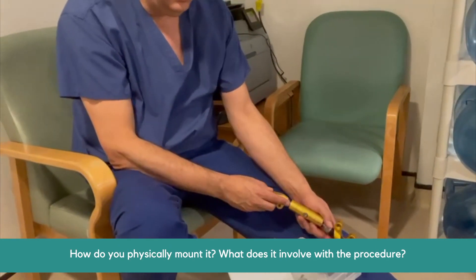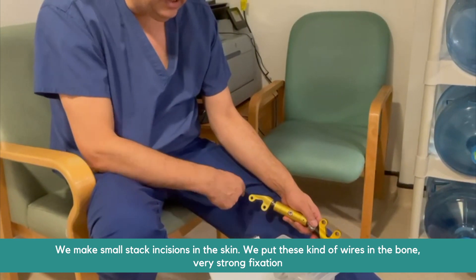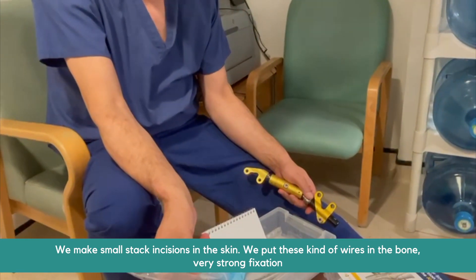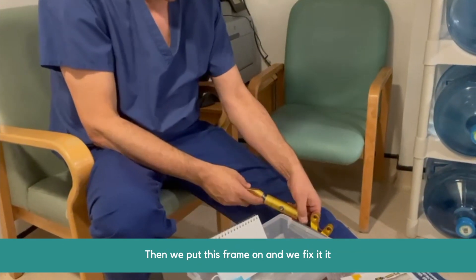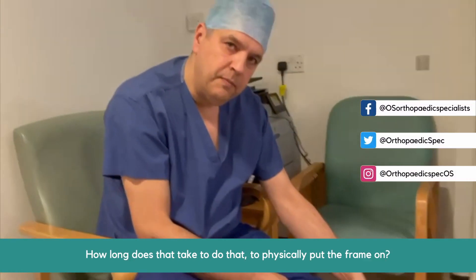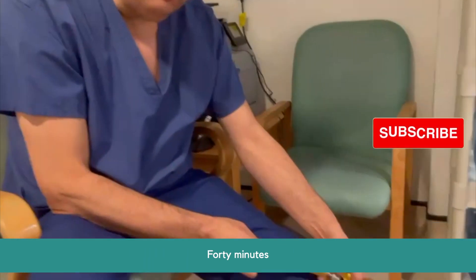How do you physically mount it? What does the procedure involve? We make small step incisions through the skin. We put these wires into the bone — very strong fixation — then we put this frame on and fix it. It's done under general anesthetic and takes about 40 minutes to physically put the frame on.